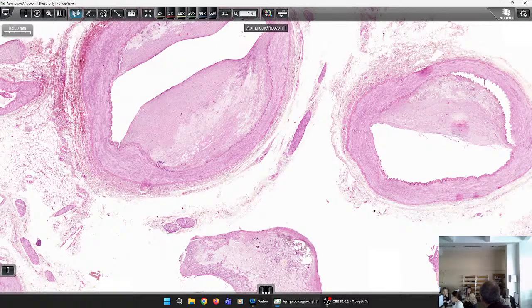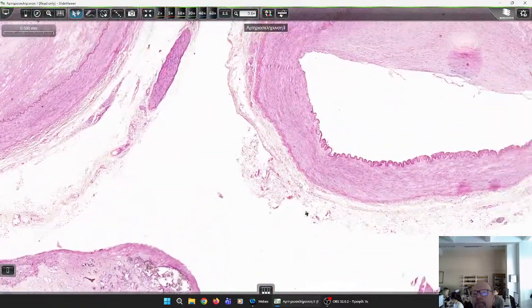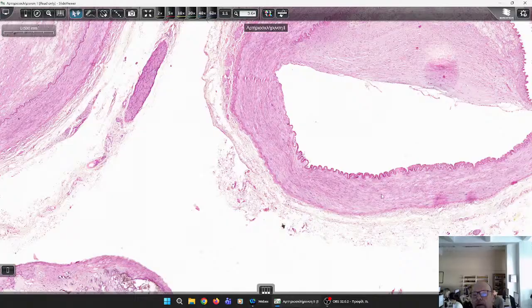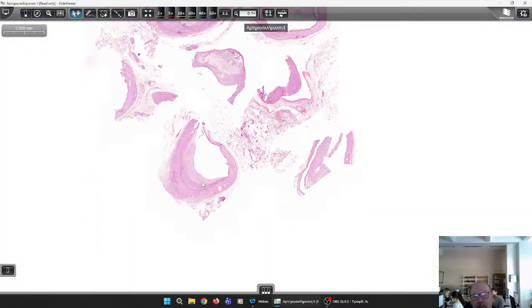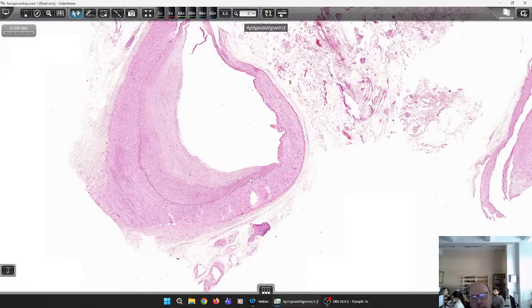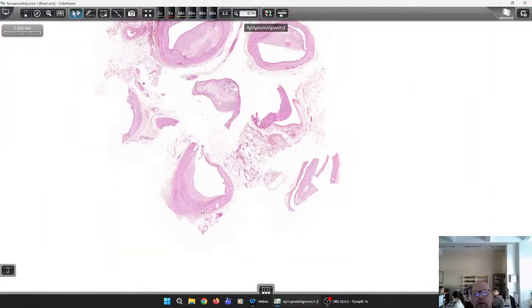Yeah. Was the lipid substance formed by the macrophages? The macrophages go to phagocytose the foreign body. The foreign body are the lipids that are deposited beneath the endothelium. So this is all. And you can see here the media, the muscular layer, because these are muscular, middle-sized arteries. You see here.